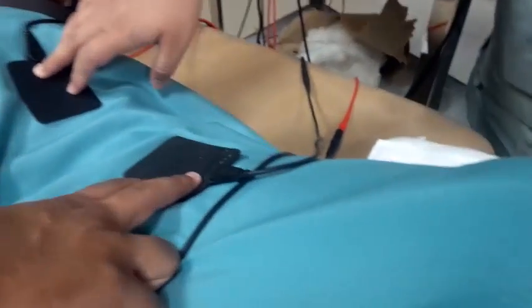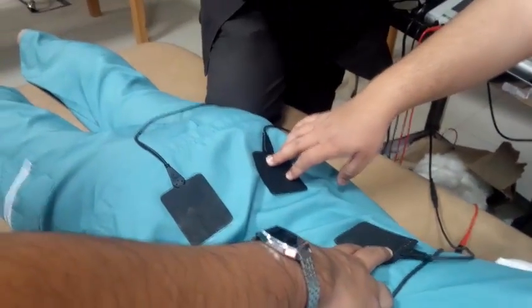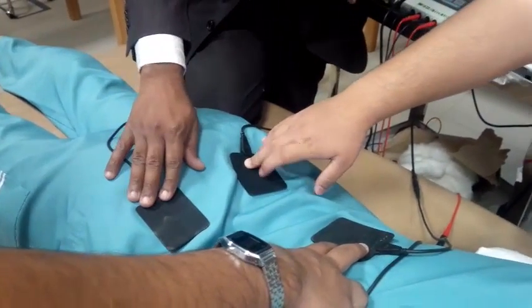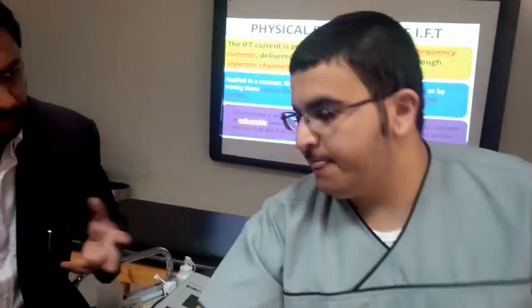Since we are using 4 electrodes, you call this one as quadripolar arrangement. Okay, quadripolar arrangement. For muscle or deep muscle pain, all these things you can use. Indications: back spasm, superficial muscles and deep muscles.